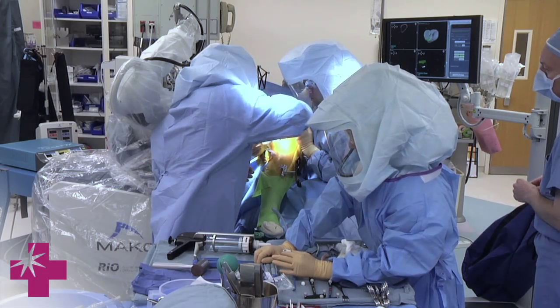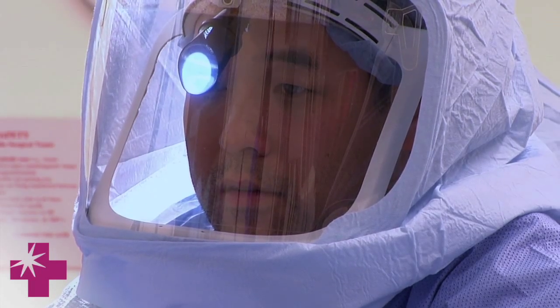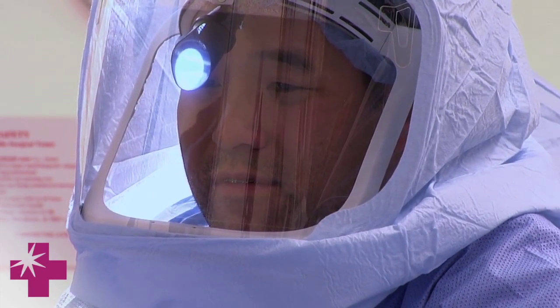In a partial, we leave all the ligaments intact. Again, it's part of how this is minimally invasive — we don't touch any of the ligaments, and with the implants in, it feels much more like a normal knee.